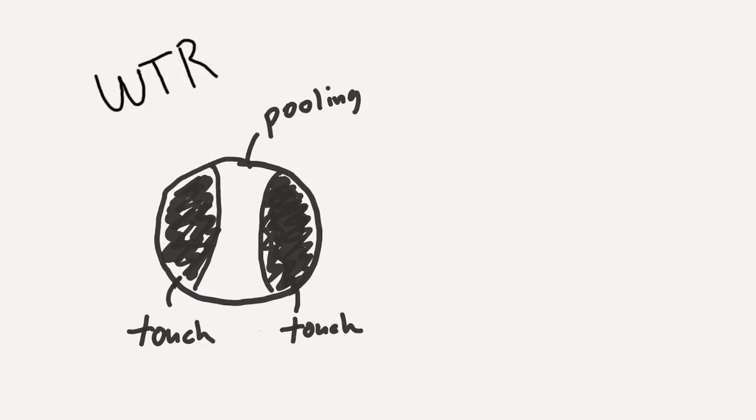All right, now we're going to talk about spherical fits over a with the rule and against the rule cornea. So let's take that to the whiteboard. So if we take a spherical GP contact lens and fit it over a with the rule astigmatism, right? The fluorescein pattern that we'd expect to see would be a situation where we would see touch horizontally, right? Because we talked about the flat meridian in a with the rule cornea is going to be the horizontal meridian. So it's going to be closer in proximity to the GP contact lens, so you're going to see touch there. What's going to happen is the vertical meridian of the cornea, right, is going to have a steeper curvature than your contact lens, so you're going to see pooling vertically, right? So the key take-home message with the rule cornea, you're going to have touch horizontally, pooling of your fluorescein vertically.